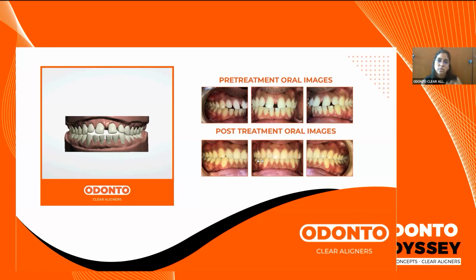You can also use the proximal strips which are available in particular dimensions. You can use those to carry it out. There is also a burr which comes specifically to break the contact. You can ask for that. It's a thin tapered burr which is available. It sometimes comes with a safety edge to it. So you can use that to break the contact.